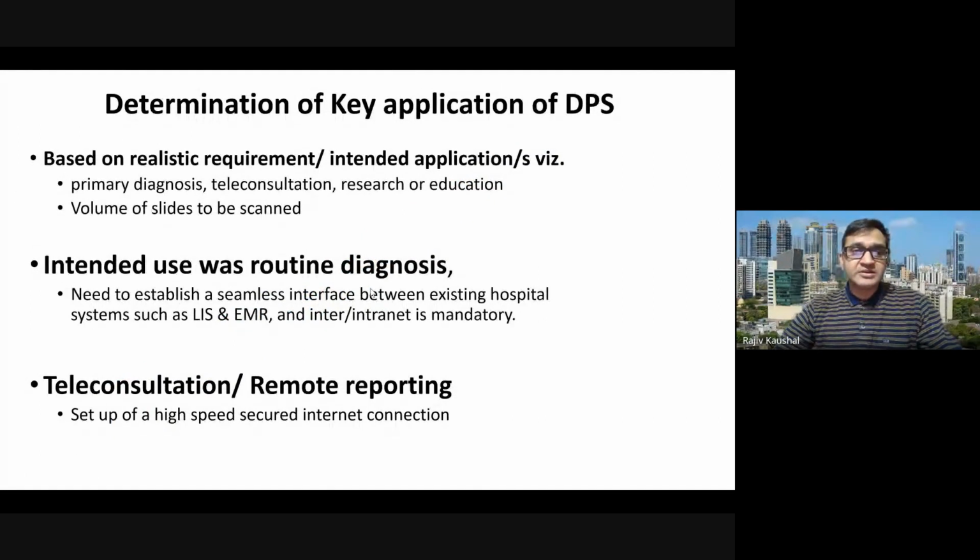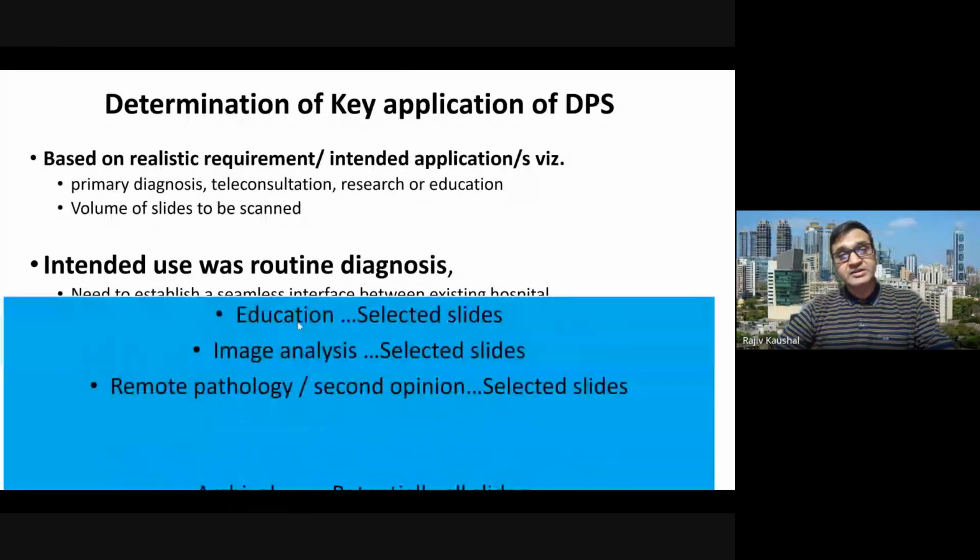So as I mentioned, the acquisition of the scanner will depend on your clinical applications, and whether you are planning to use it for primary diagnosis, teleconsultation, or research. If it is for primary diagnosis, then the aim should be to integrate into your existing LIS and EMR system. And if the idea is for teleconsultation or remote reporting, then you need good, high quality internet connectivity outside.